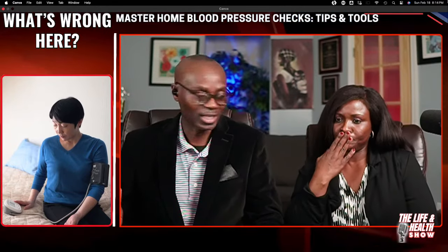Sitting on a bed, no chair to support the back, crossed legs perhaps, or hanging legs, the cuff not tight enough, and also on a shirt, and the tubing on the side, not in the middle of the arm. Those are the easy things we can find, as well as her body turned, right? Mm-hmm. All right, so that is that. Now let's move on. There's another.